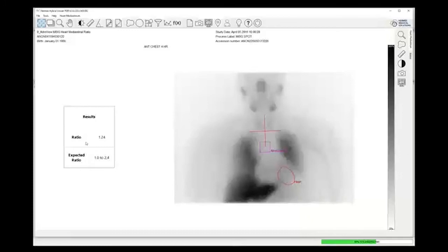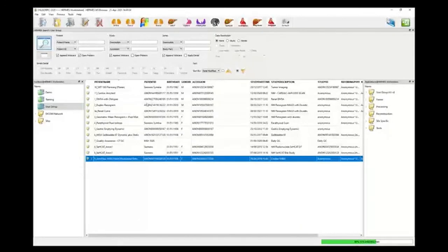As I say, I don't claim to be familiar with AdReview at all, but I did find some references to the ratio being useful for identifying patients in terms of mortality risk. So if they've got a lower 1 or 2 year mortality risk, they've got a higher ratio, or over 1.6, I think it was, in terms of the ratio. So it seems to be, I guess, stratification, and identifying risk. So that's something that's new.